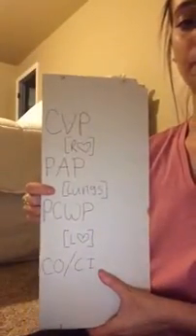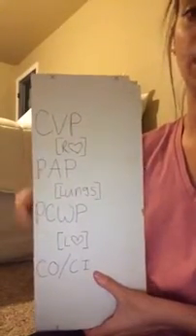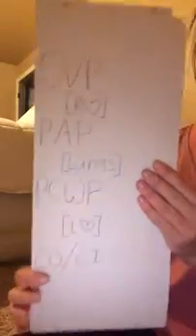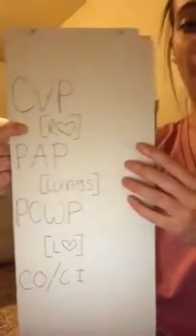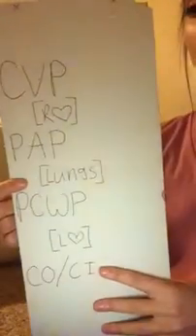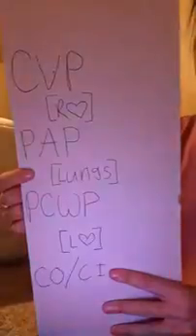And then if you had a question and the CVP was high and then the CVP was low, you would know that the issue was within the right heart, and so on. If the problem would lie within the right heart, you would think that the disease would be like cor pulmonale. Some issues that would happen within the lungs would be a pneumothorax, pulmonary embolism, air embolism. You could have hypertension or increased pulmonary vascular resistance. This would be like a COPD.